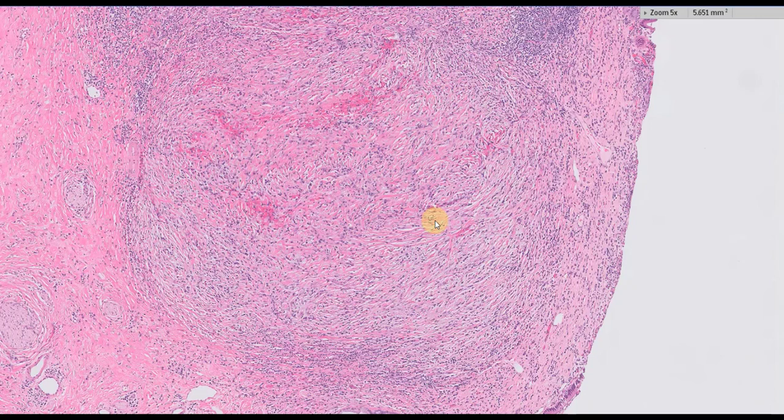Now, there are other diseases that can cause a fair amount of inflammation of the bile duct. Classic example, primary sclerosing cholangitis. In fact, you can have elevated numbers of IgG4 positive cells in primary sclerosing cholangitis. You can have elevated numbers of IgG4 positive cells associated with a cholangiocarcinoma. So you cannot rely on the stain. The good old H&E will get you the answer.